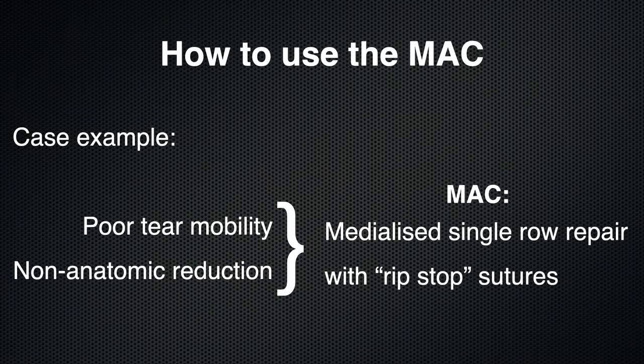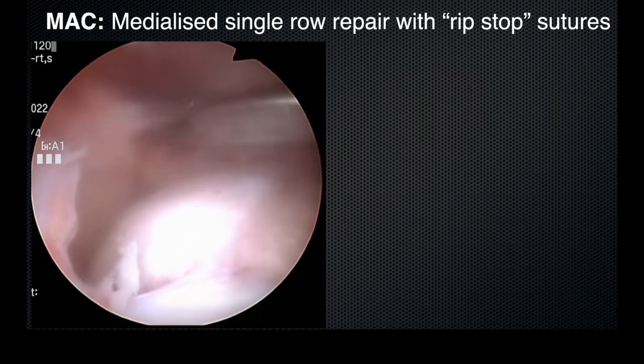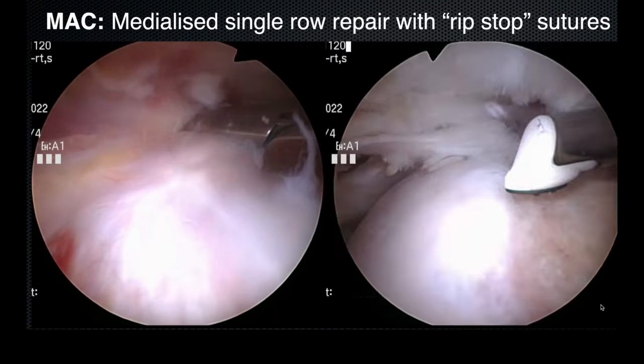In the case of poor tear mobility and a non-anatomic reduction, such as this tear, a medialized single row repair with free ripstop sutures is chosen.